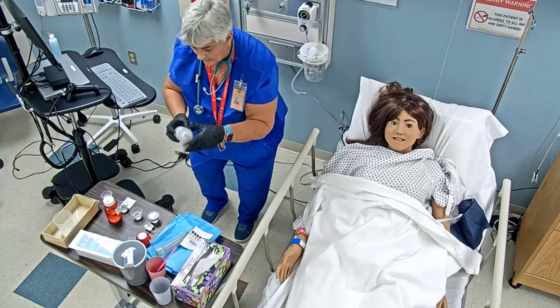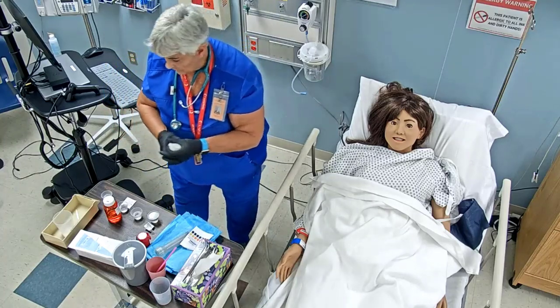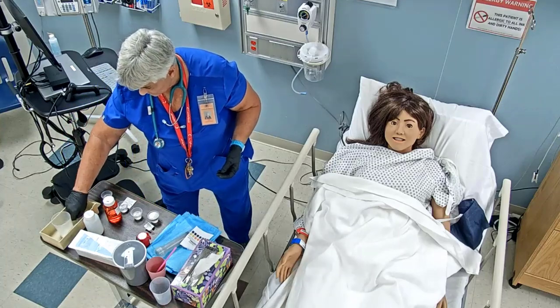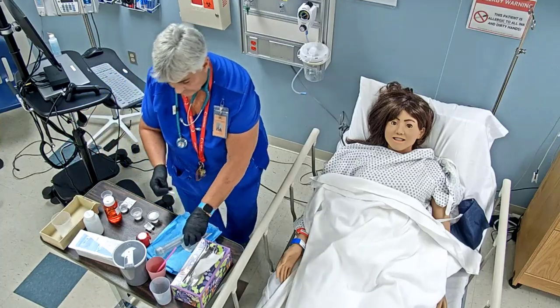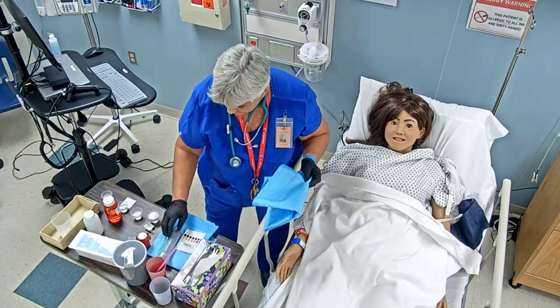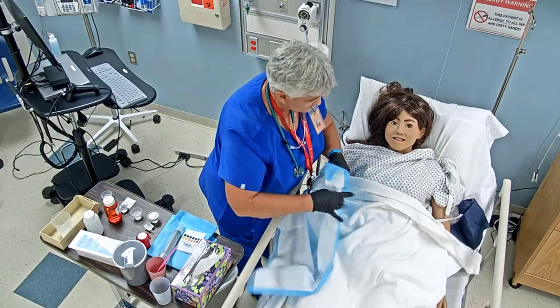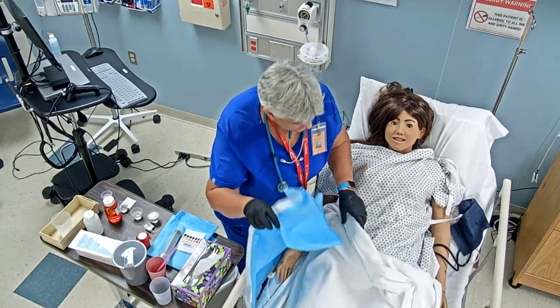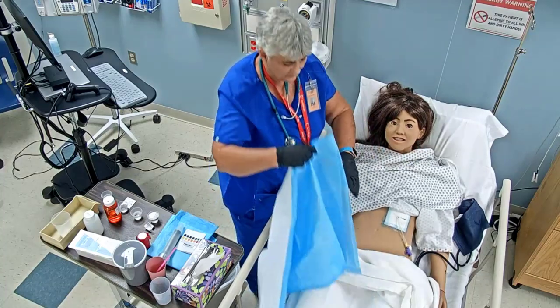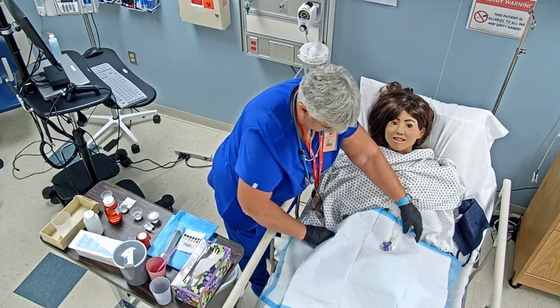And with my water, I had checked it prior to, also making sure that it wasn't expired and that it was intact as well. Okay, so again, we want to make sure that you're staying at this level for at least an hour. And if we have tube feedings, you're going to stay at 30 degrees at all times, okay?